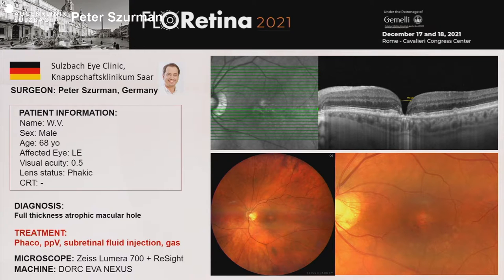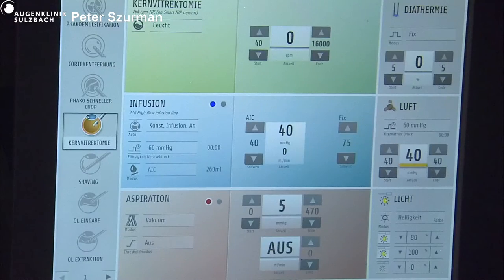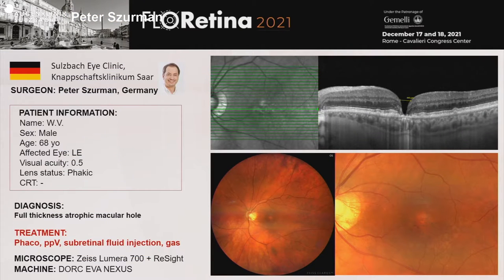I totally agree, and I like to pose these controversial discussions in such an exclusive panel like we have. So, in fact, I was thinking if it's necessary, but I don't believe that a simple ILM peeling is such a trauma. And I want, of course, to avoid any tangential traction. Basically, tangential or persistent tangential traction is the reason for persistent macular holes. But in this special case, Peter, I don't think that it's 100% necessary.